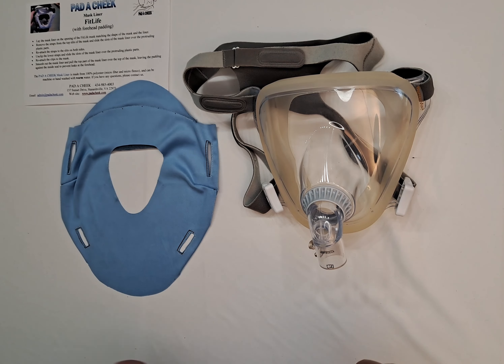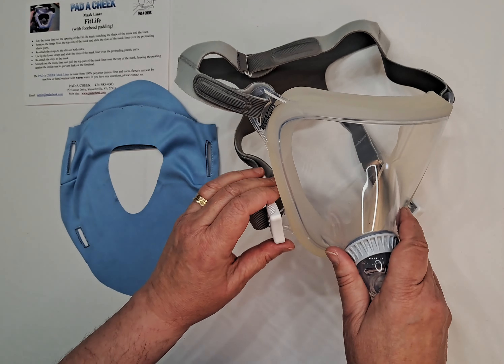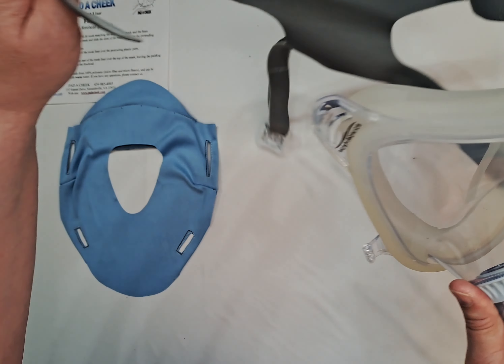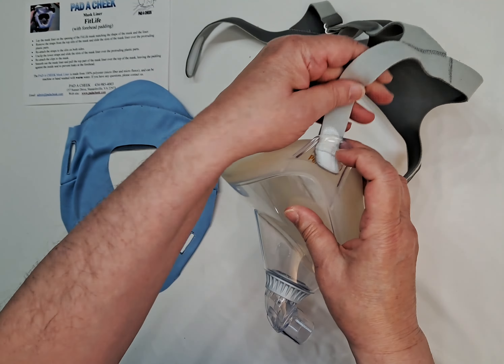This is installing the FitLife Mask Liner on the FitLife Mask. Remove the headgear straps by releasing the clip and the Velcro on both sides like this.